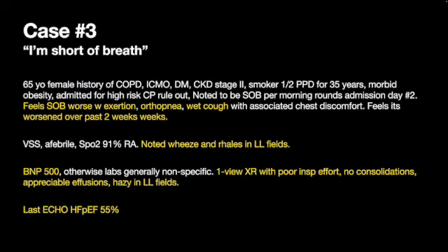Next case, still undifferentiated dyspnea. Same patient, right? She's still complaining. I'm sorry, same patient. She's 65 years old, still has the same lung pathology, cardiac pathology, admitted for high-risk chest pain rule out. You go and see her on admission day number 2. Say, are you feeling better? Are you ready to go? She says, no, I'm actually feeling worse. I'm short of breath with exertion. When I lay flat, I feel really short of breath. I have this nasty wet cough, and I feel like it's actually been going on for some time and it's worsened.